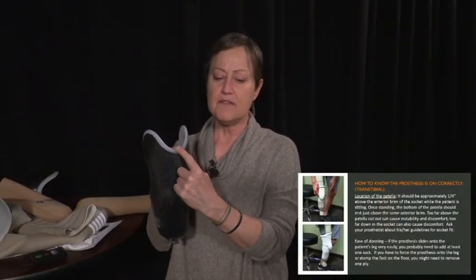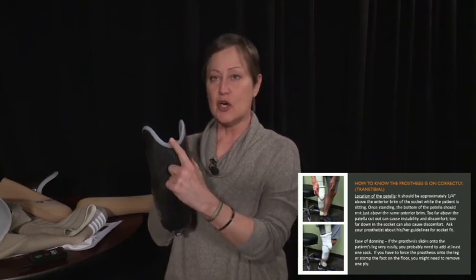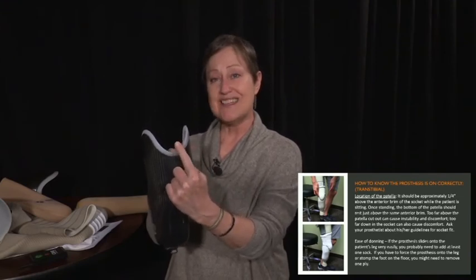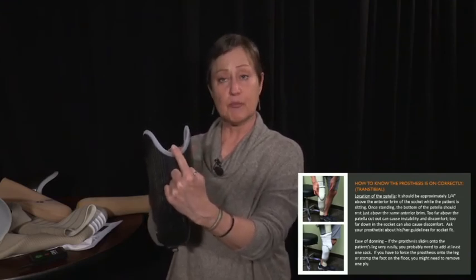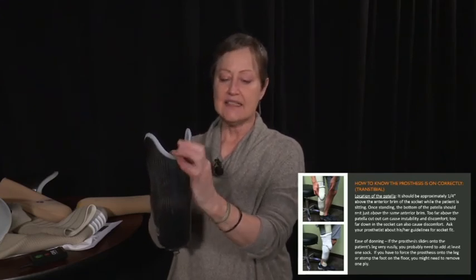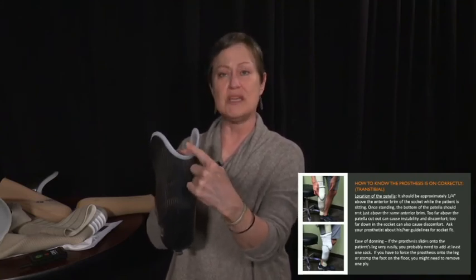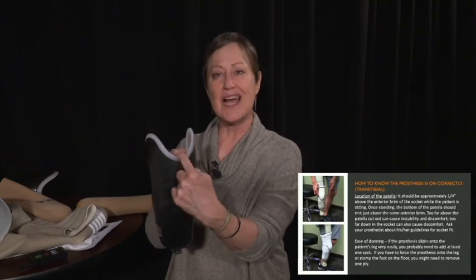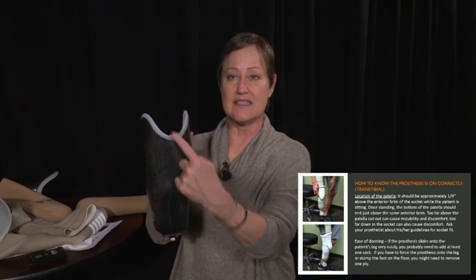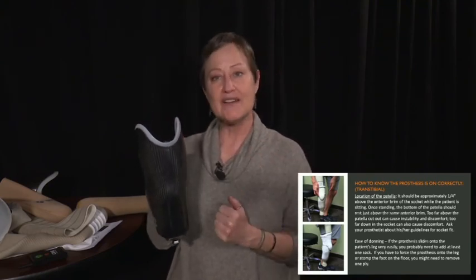If the patient is sitting with this prosthesis, there should be about a 1/4 inch from the brim of the socket to the distal aspect of their patella in sitting. Then when they stand, that's reduced, but we don't want their patella hitting the brim. It needs to be just proximal to it. Imagine how much pain you would have if your knee kept whacking into the brim of that socket, which could happen if you're not wearing enough socks.